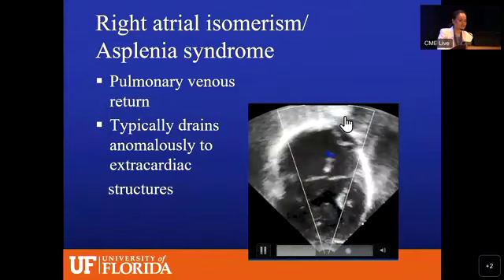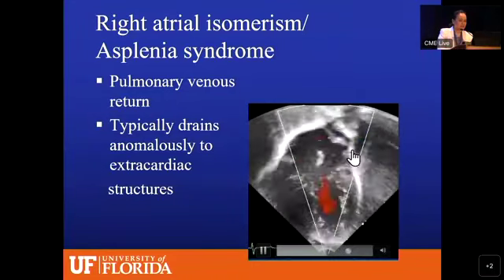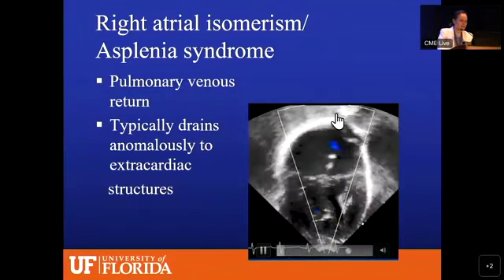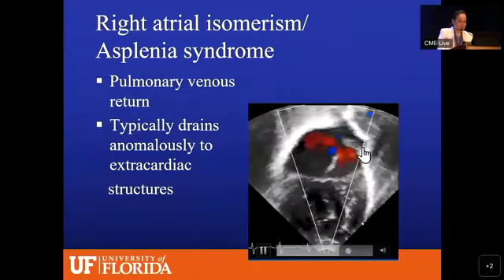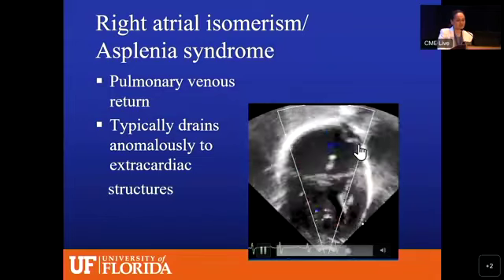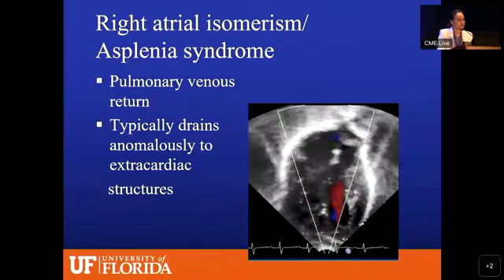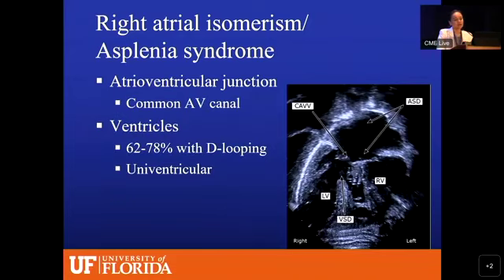You could see that if you see this structure on the left, up near the left-sided atrium, where there's that little wall, and you cannot prove that there are pulmonary veins both by 2D and color, then it's total anomalous pulmonary venous return until proven otherwise.